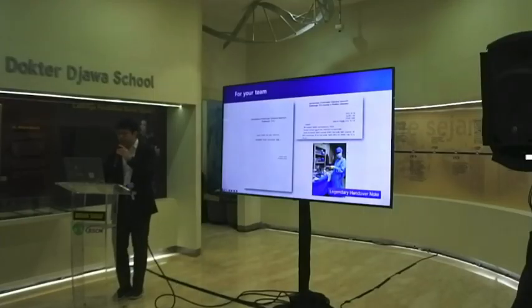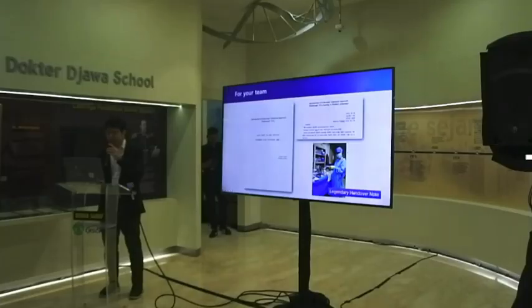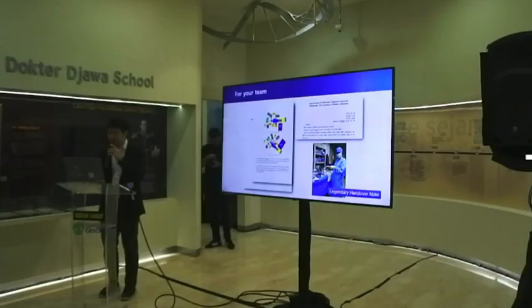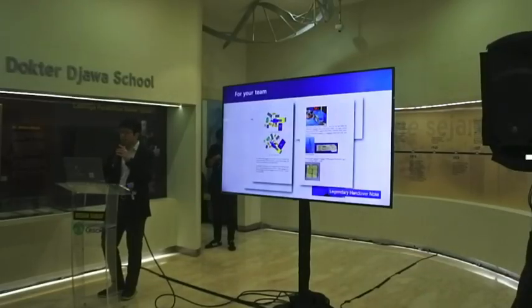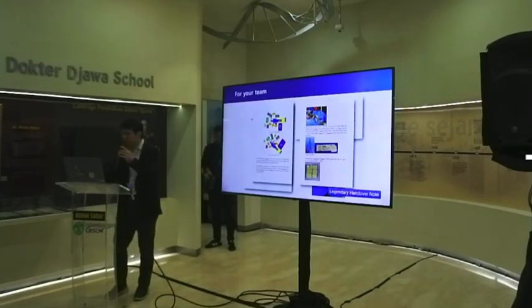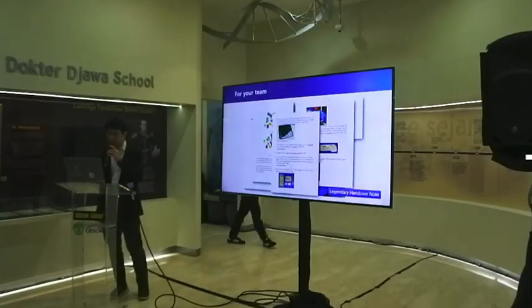This slide outlines a detailed surgical procedure, particularly for the removal of pituitary adenoma. It mentions using various instruments like a dissector, ring curette, and forceps to remove the tumor. Professor Kim showed this slide yesterday, and most of the knowledge is from Professor Kim. The procedure also includes the steps for irrigation, managing CSF, and packing the nasal cavity with materials like Nasopore tampons at the end of the operation.